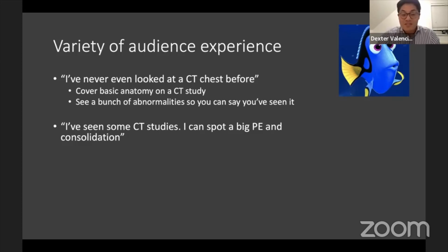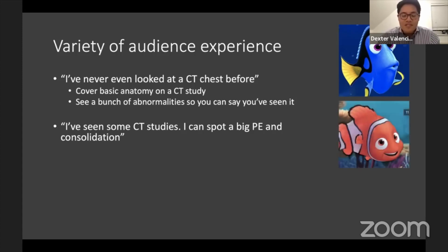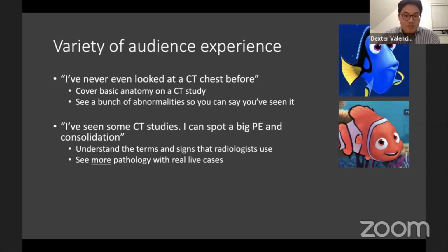For some of you, you may have seen some CT studies, either looking online during studying or in any of your hospital attachments or your work placements, and you can see a few things like you can spot a big PE, you can see some infective consolidation, so you have some experience within the field of radiology. Maybe for you, you want to sharpen up in terms of your language, the terms, and maybe some of the signs that the radiologists use to describe what they're seeing, and also to see more pathology on top of whatever you've already studied or seen in hospital.